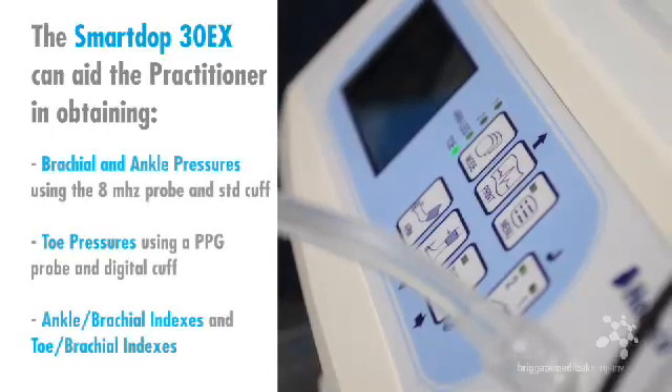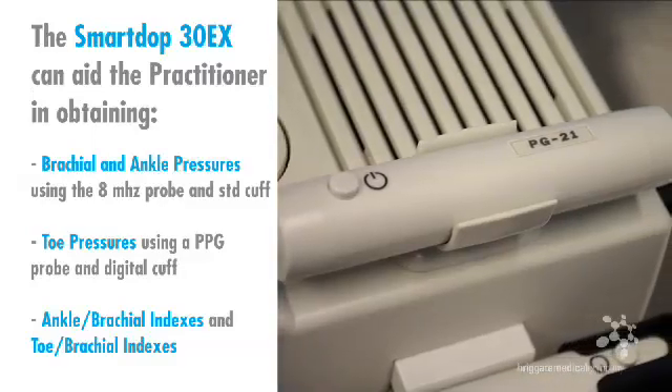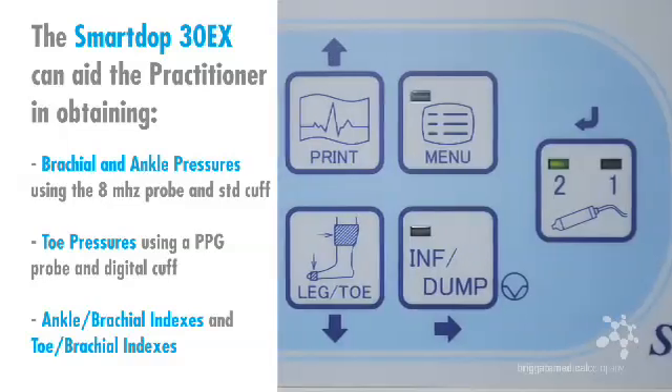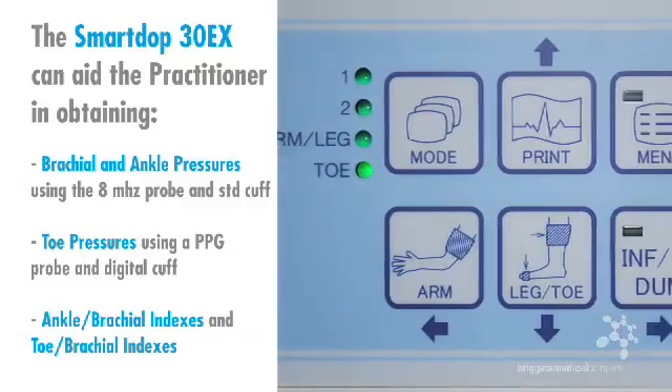Brachial and ankle pressures using the 8 MHz probe and standard cuff. Toe pressures using a PPG probe and digital cuff. And how this Doppler interacts with the HEDECO SmartLink software to present and obtain both ankle brachial indexes and toe brachial indexes.